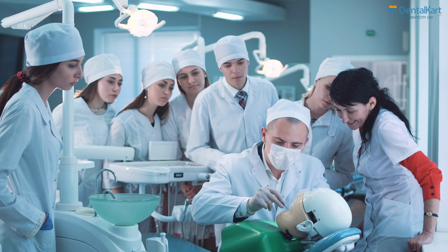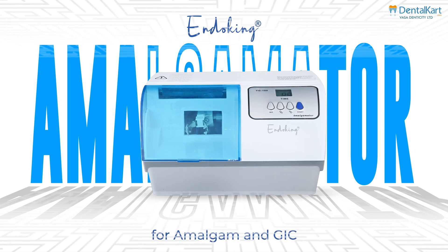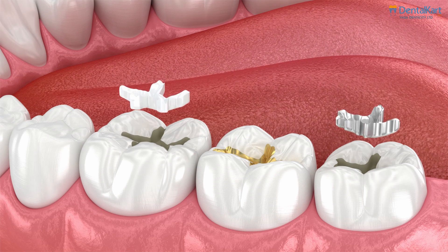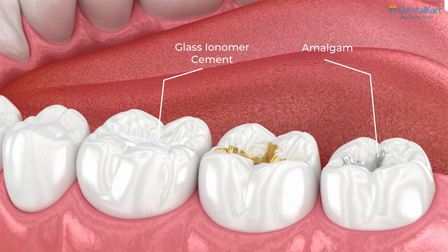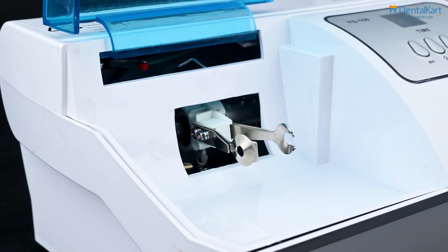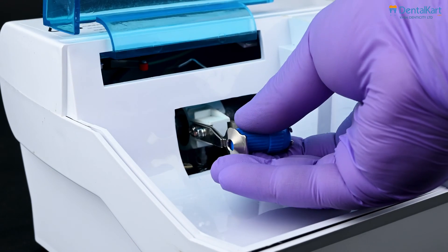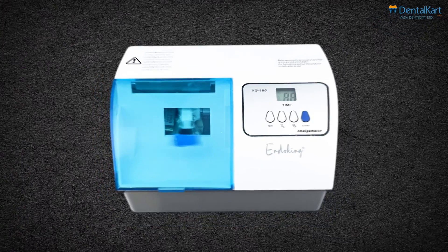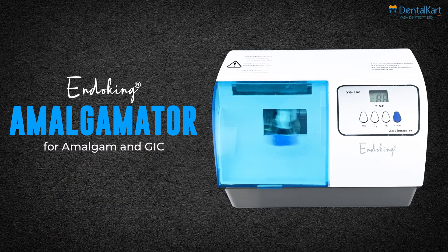In the field of dentistry, a dental amalgamator like this one is essential for blending restorative materials, such as silver amalgam capsules and glass ionomer cement. The main components include a series electric motor and a holder for receiving the capsule with the materials to be mixed, providing the perfect filling compound. Let's know more about the Endoking Amalgamator.